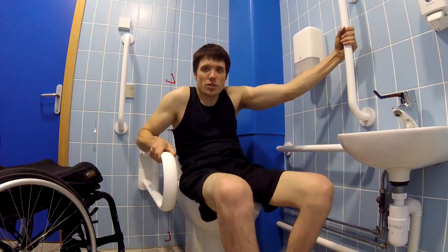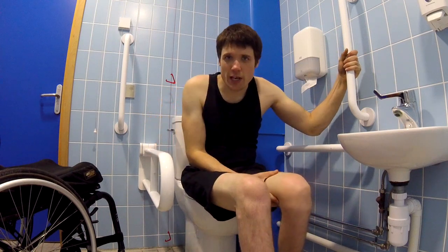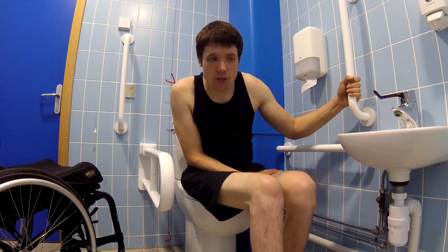Now this vertical bar here is mainly for people who struggle to get into a standing position. I never get into a standing position, so I don't think the bar is particularly useful for me personally.